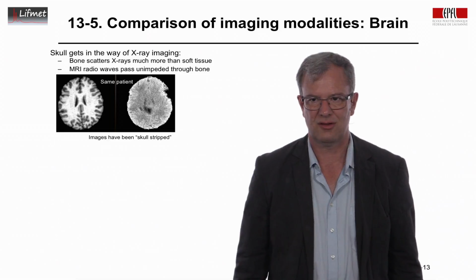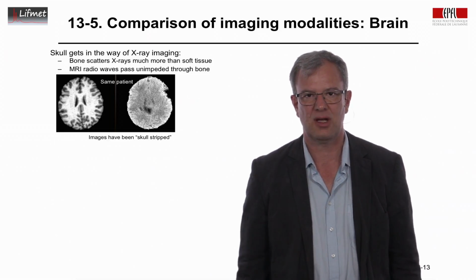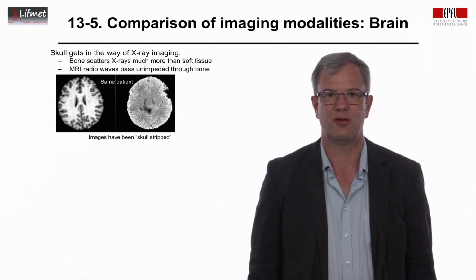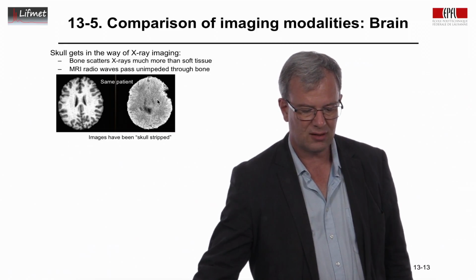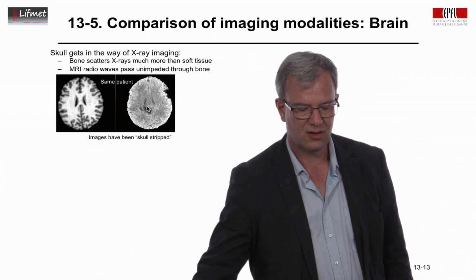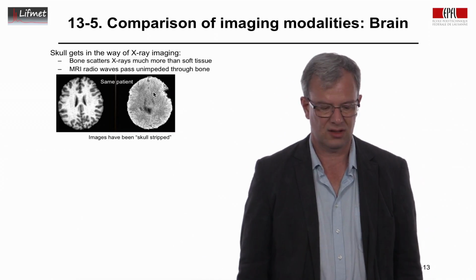Now this is not what it implies physically. It's not stripping the skull of the patient. It's stripping it by software means, so we don't see the signal from the skull. We're just looking at the soft tissue. And you can see on the left we have exquisite contrast with the gray-white matter, and on the right, on the CT scan, it is essentially grayish for the same slice in the same subject. We're seeing not as much contrast on the CT scan.